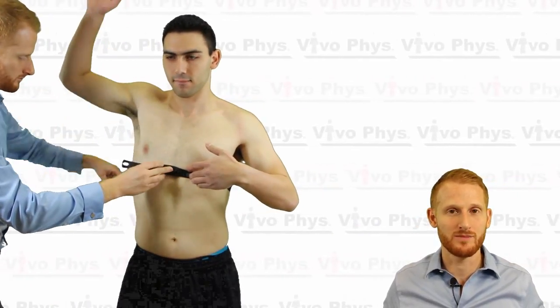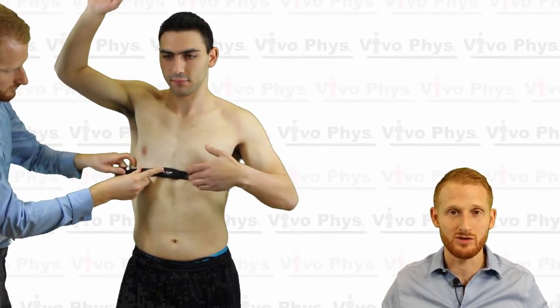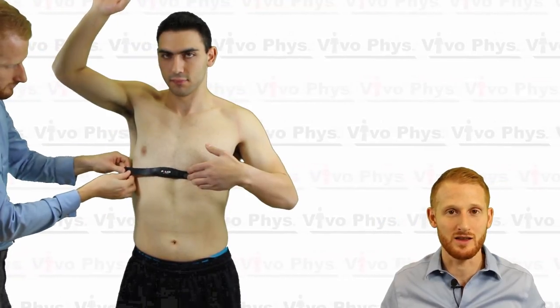Some people are going to have a little bit of a concave shape to their chest. If that is a very extreme concave shape, you might have to move the strap a little bit up or a little bit down to avoid the gap that would be created between the heart rate strap and the chest itself. Just make sure that the electrodes are applied to the chest so they're in direct contact with the skin.